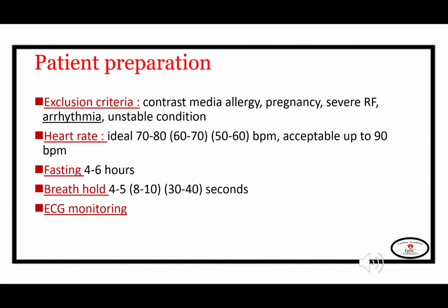The patient has to be fasting for 4 to 6 hours, and he or she has to be able to hold the breath for 4 to 5 seconds. And again, this is a major improvement regarding the older generation, which required longer breath holds of up to 40 seconds. This technique is ECG gated, and continuous ECG monitoring is mandatory.